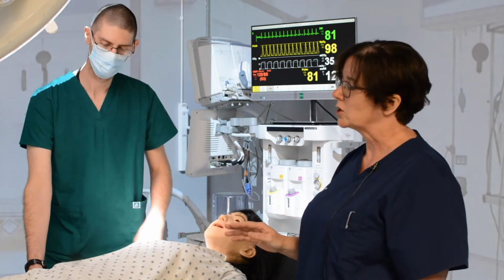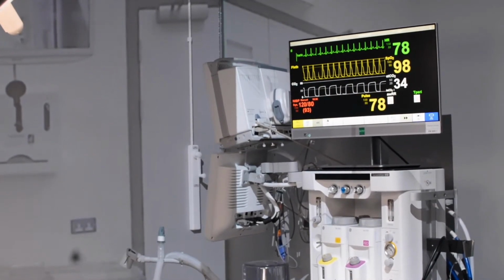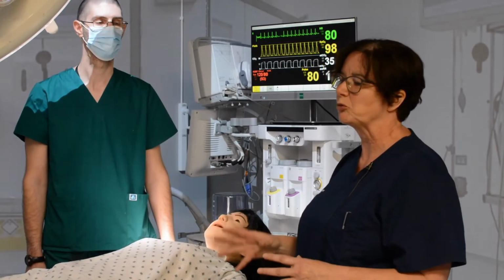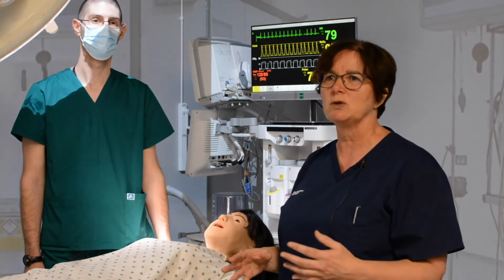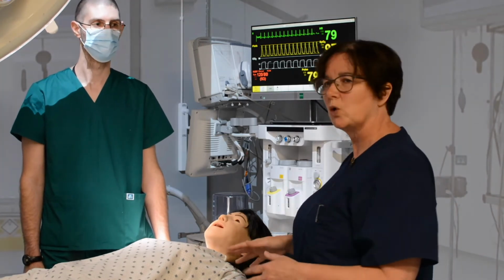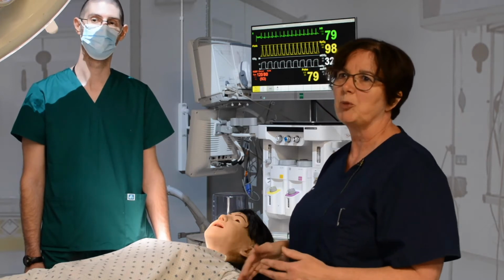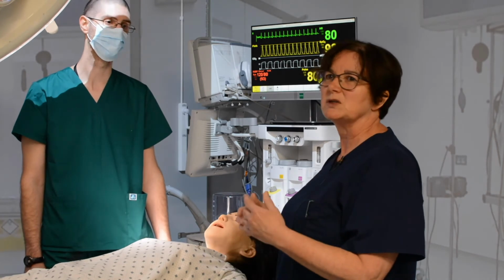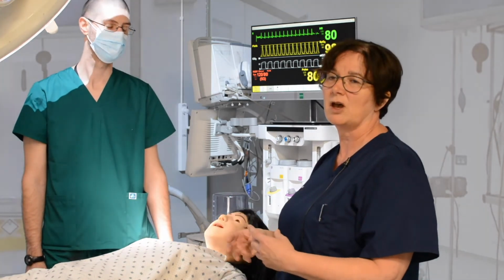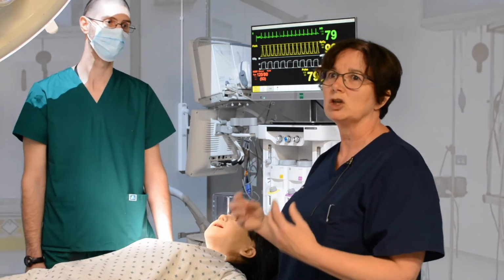We can do basic skills on her, so we can catheterise her, so we can train students to catheterise the mannequins, and we can put other sorts of modules for mannequins on her so that we can do wound care, etc. She can talk, so she'll do generic yes/no answers, she'll make some noises, but also we can get students to interact with the mannequins because there's a microphone in the chest, so that I can then speak to the student through the mannequin using a headset and microphone.